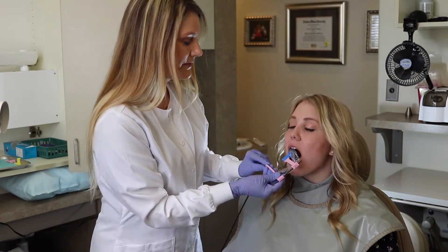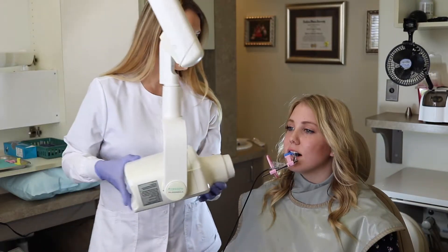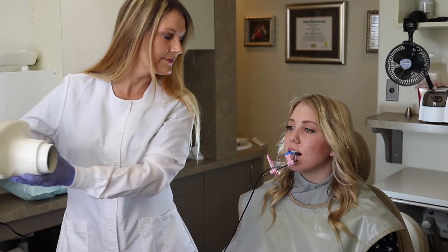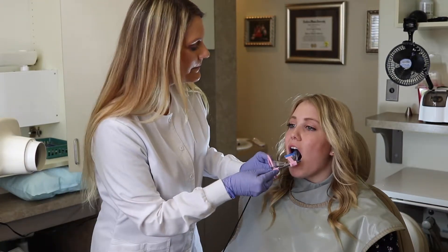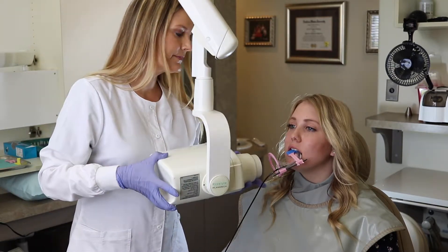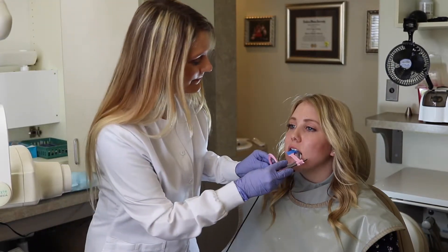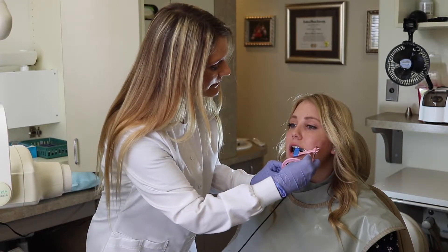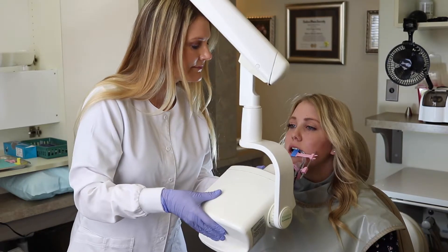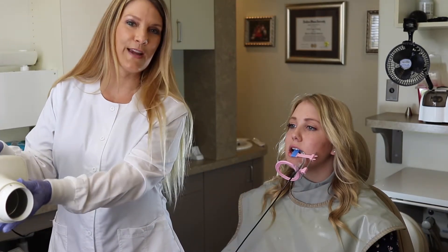We're going to go ahead and do the lowers and the last one, and with that our anteriors are complete.